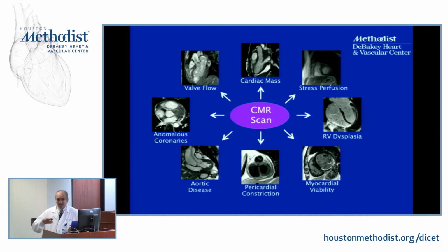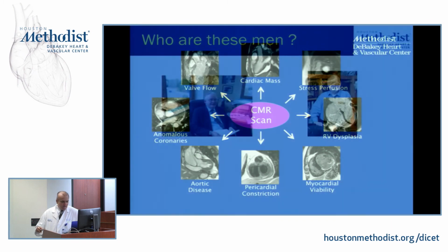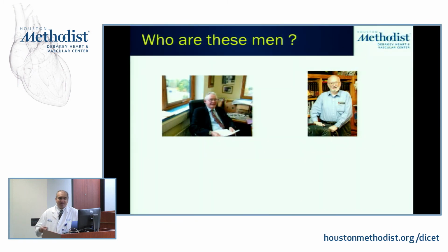Throughout this year, in this conference, we'll go through the role of MRI in cardiac masses, in perfusion, in valve assessment. But what I want to talk about today is really just the basics of how MRI works. So the first question, I guess, is who are these two guys? These two old guys?